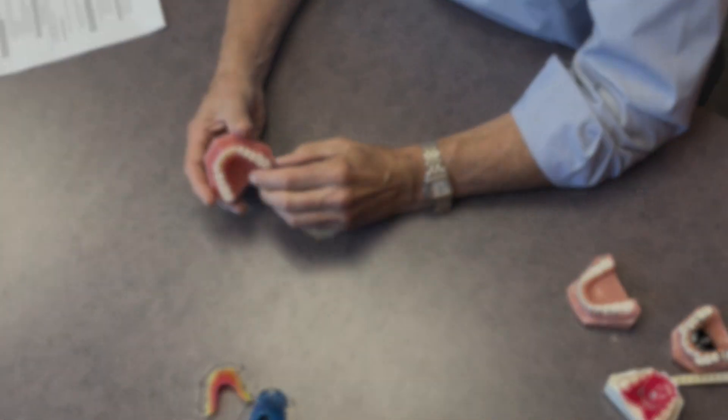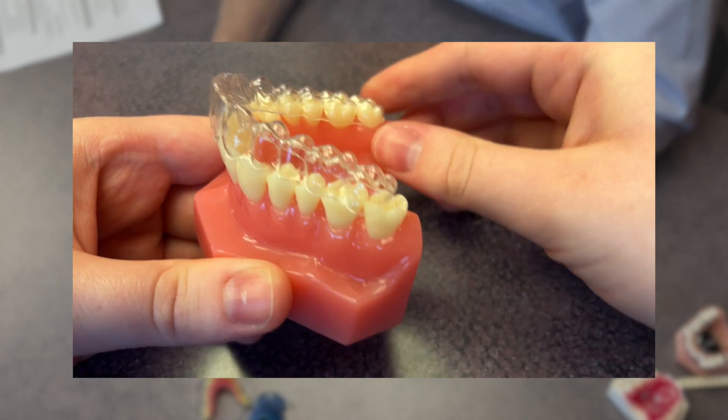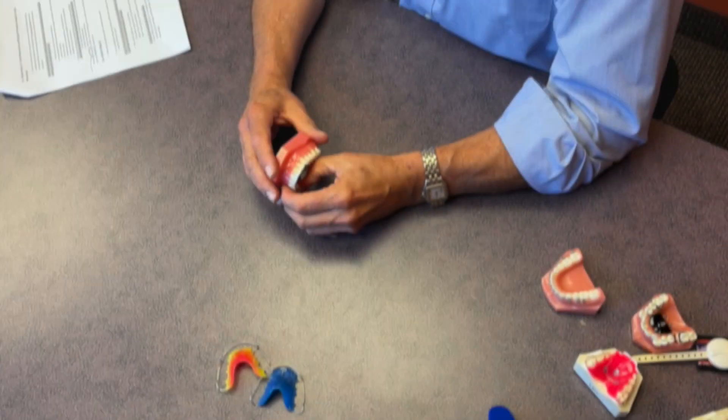Another form of removable appliance is an aligner. These have been in use for over 20 years and are technologically very sophisticated in how they move teeth. Aligners move teeth two to three tenths of a millimeter with each aligner change. A treatment plan sets up teeth to move from a starting point to a finish point, creating a series of models that successively move those teeth small amounts to that finish line.